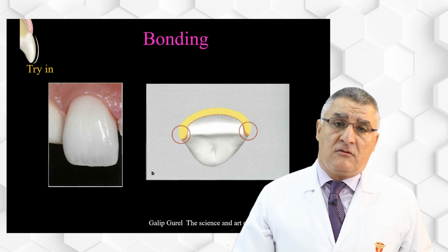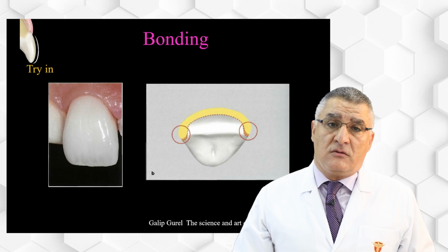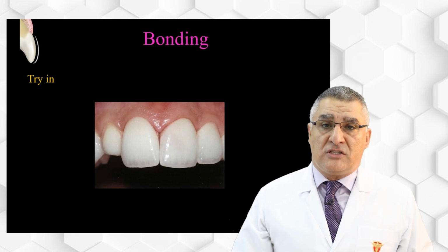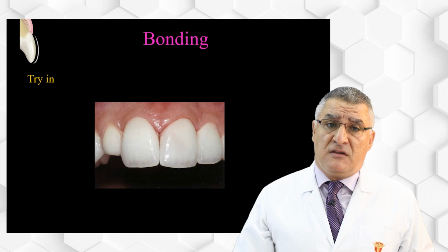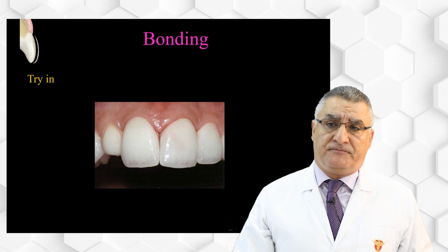Then you have to check it two by two, because sometimes you may have one veneer that fits completely, but when you put two adjacent veneers together, they cannot be fitted together because one may interfere with the other. For example, start with the two central incisors, then go to the right central with the right lateral, and the right lateral with the right canine, and so on. So you have to check that every veneer will not interfere with the adjacent veneer.